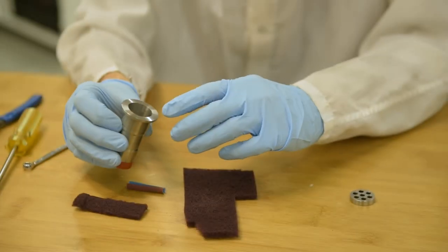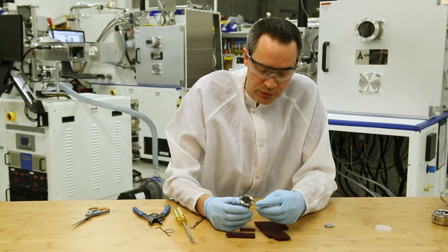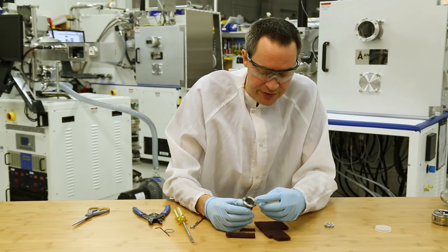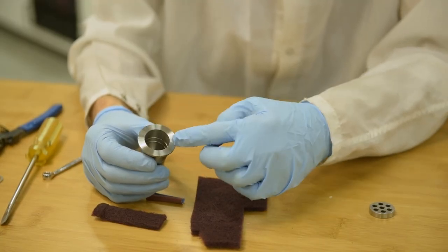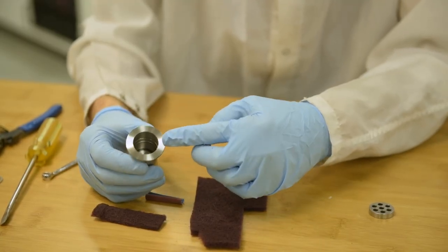Here we have a few small scratches that I'm going to polish out. We're concerned about scratches that may be a conductance path across the o-ring as it seals to the flange on the chamber.